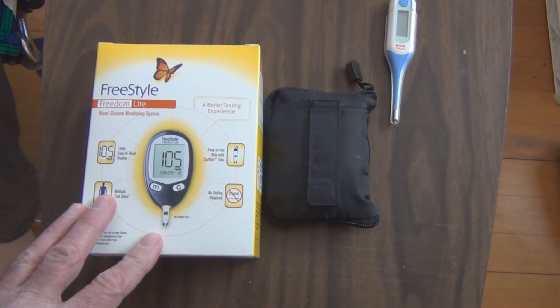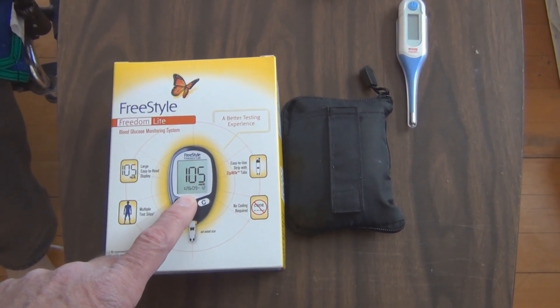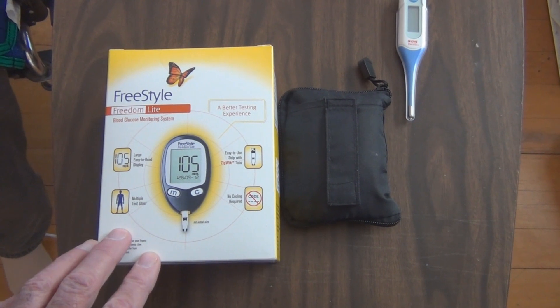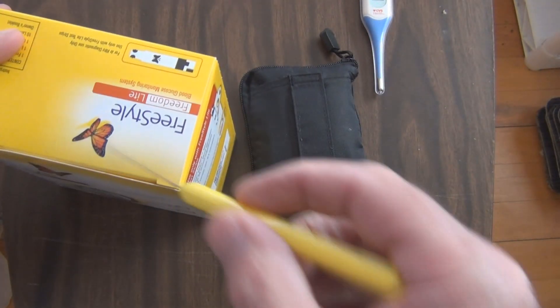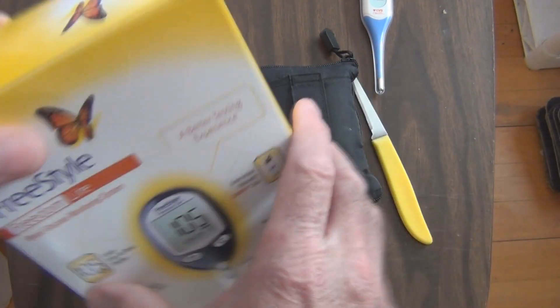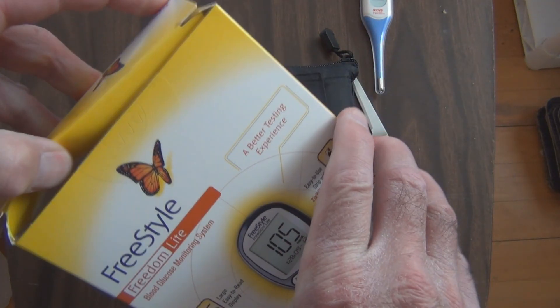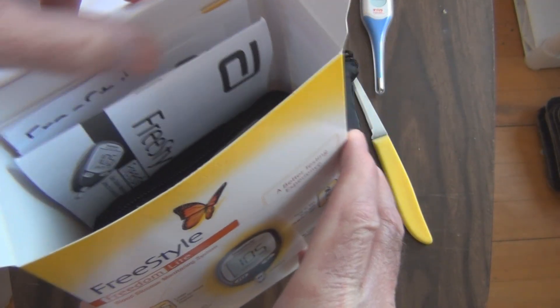So let's open it up and take a look. I think I have to enter in the time and the date before I get started. I have to check my mother's glucose because she had a stroke several years ago and she's unable to do it herself. She has since gained weight and that has resulted in type 2 diabetes.